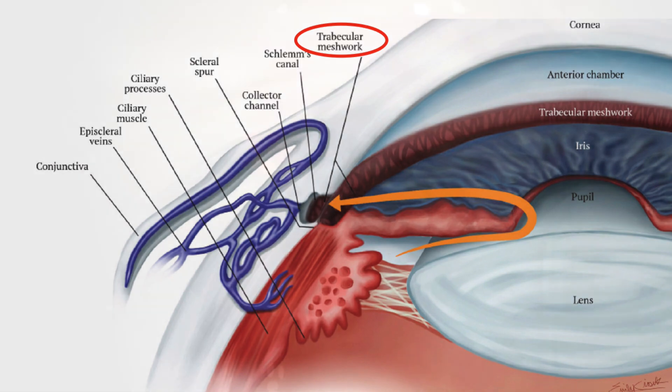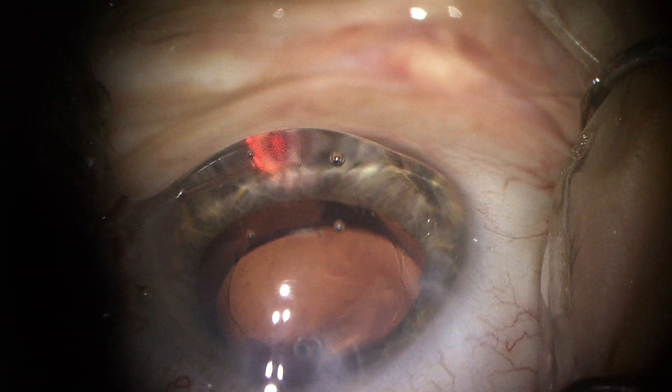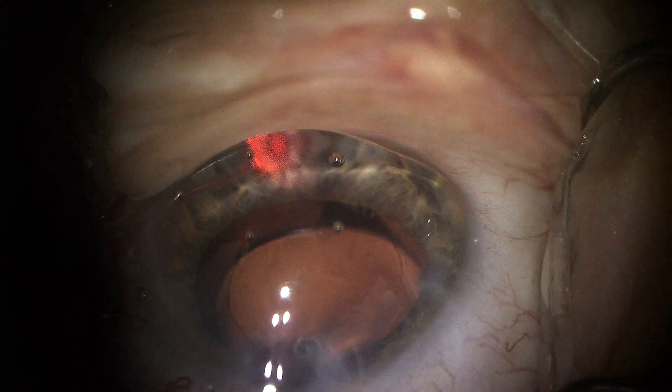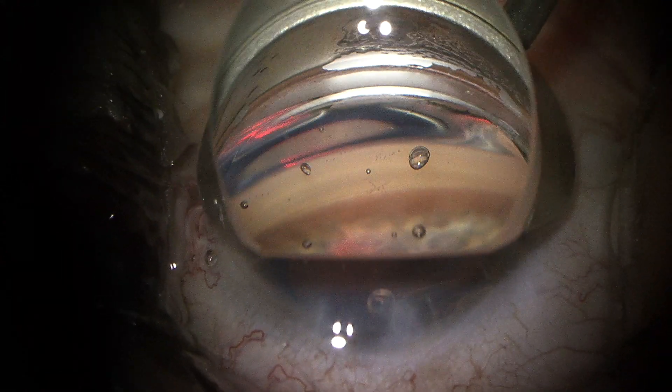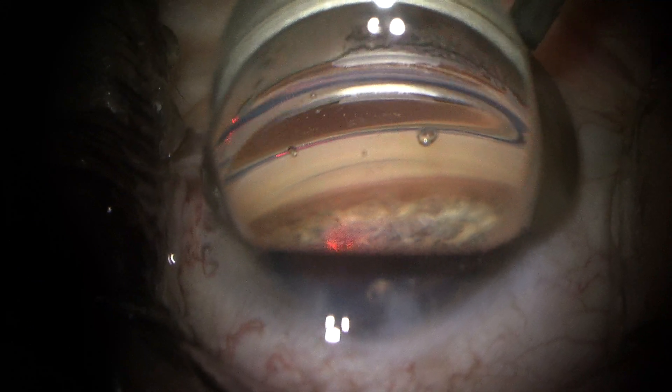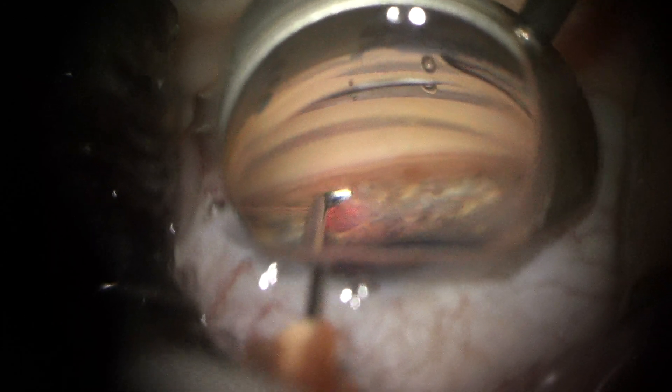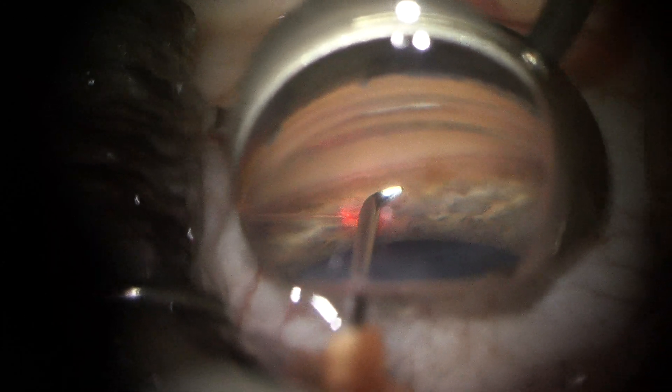Now let's switch from a schematic view to an inside-the-eye view. In this video, I have a lens over the cornea called a gonioprism, and it allows me to see the angle from an internal view. The first step to augmenting or increasing the drainage capacity of the human eye is to make an opening of the trabecular meshwork. This opening is called a goniotomy, and it is made with various different devices and can be made large or small.